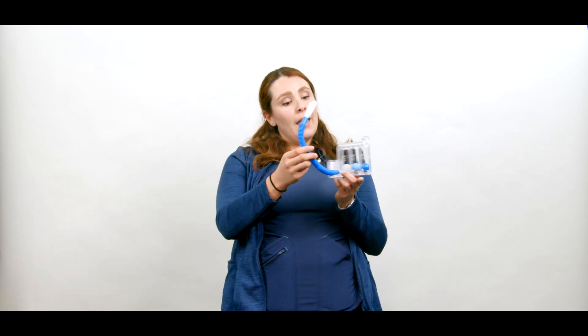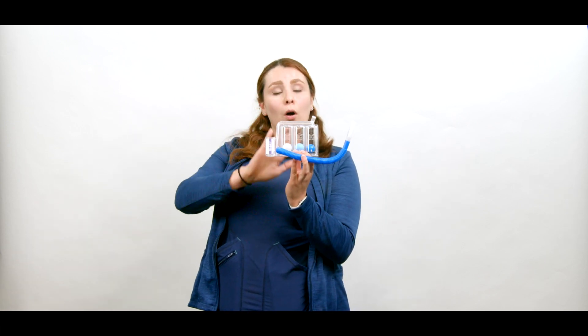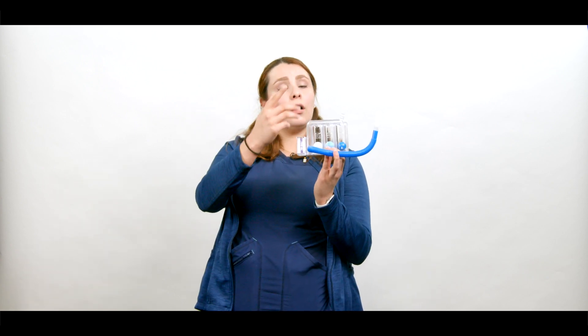To use it, connect the breathing tube to the air chamber, place your mouth on the mouthpiece, and do slow and deep inhalations. The goal is to try to lift all three balls at once and hold all three balls for around three seconds. That counts as one exercise.